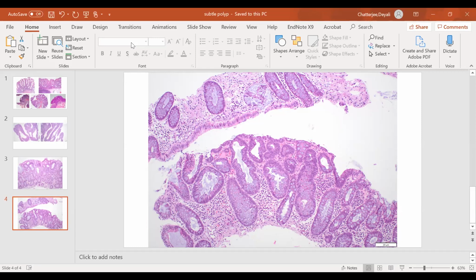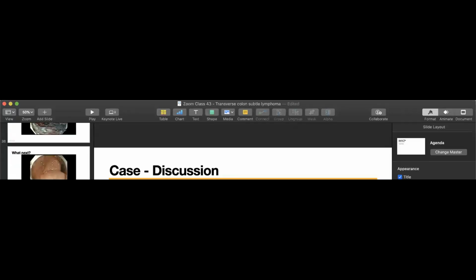May I ask a question to the pathologist? Yes. Thank you so much for sharing these beautiful slides. My question is, what would be your clinical diagnosis corresponding to these pathology findings? In the end, we would like to know what the patient most likely has in order to determine the best surveillance interval. So what would be the clinical diagnosis of this case, in your opinion?